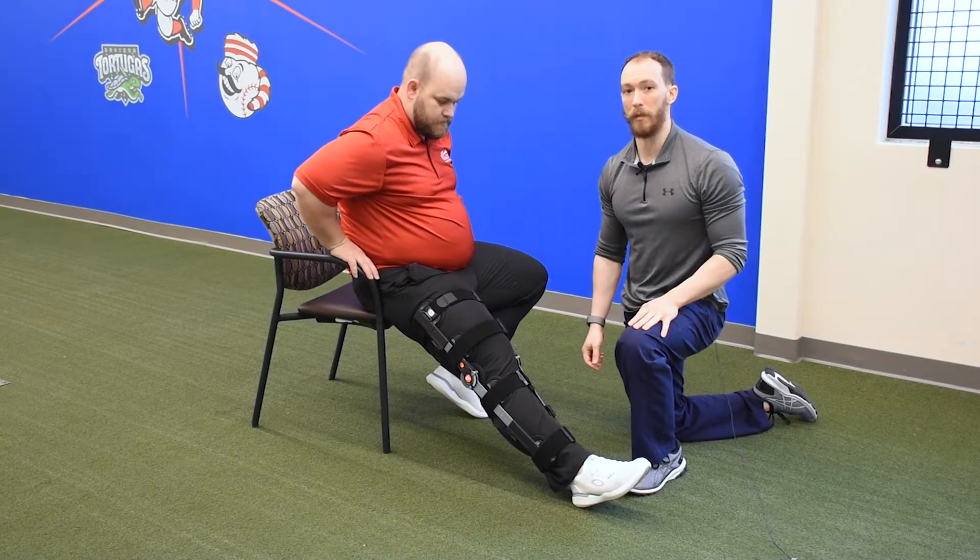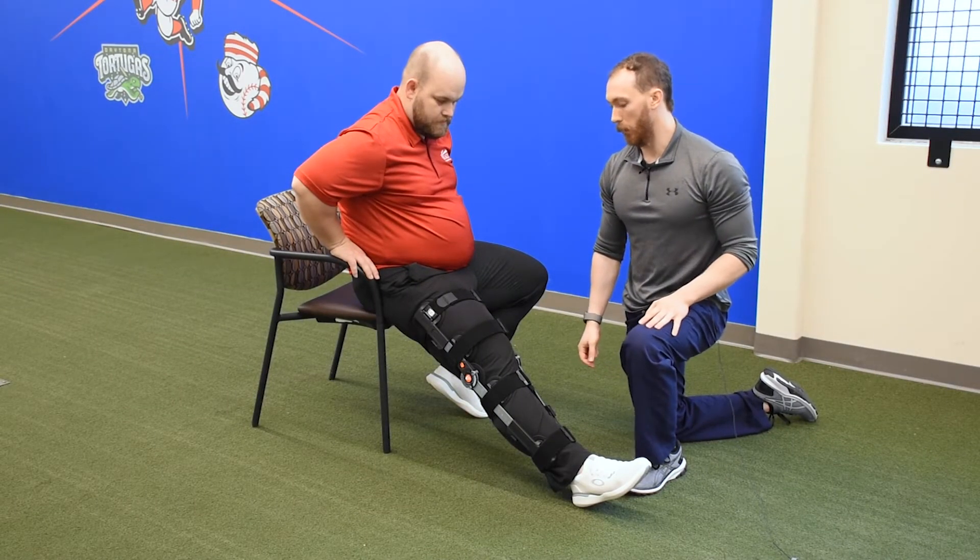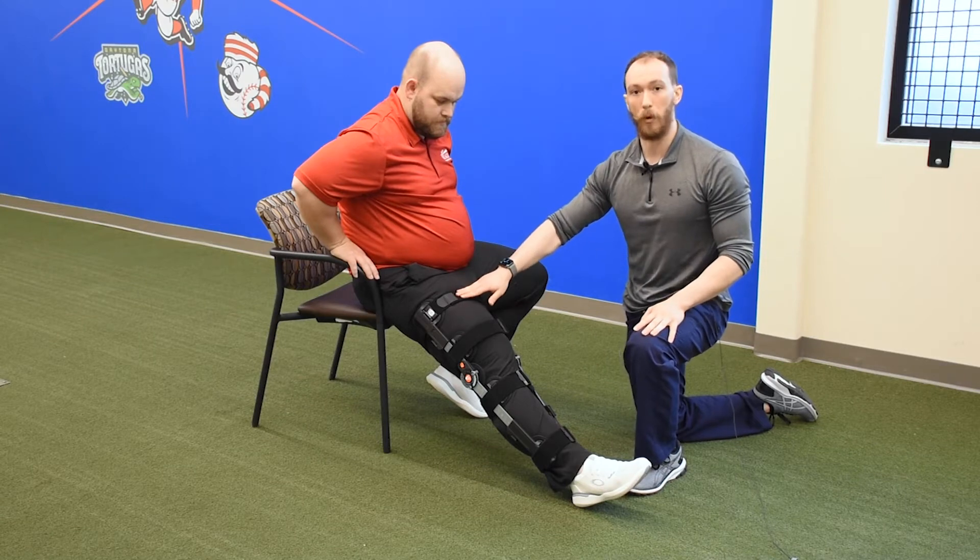Hi, my name is Rob. I'm with Beacon in the DME department. Today we're going to go over how to take off the post-op knee brace.